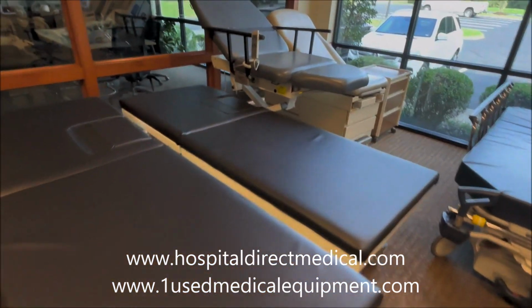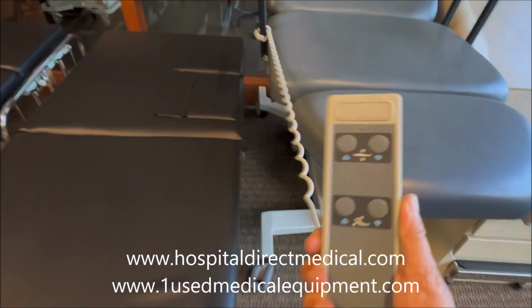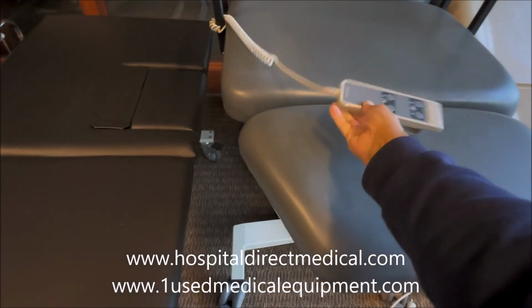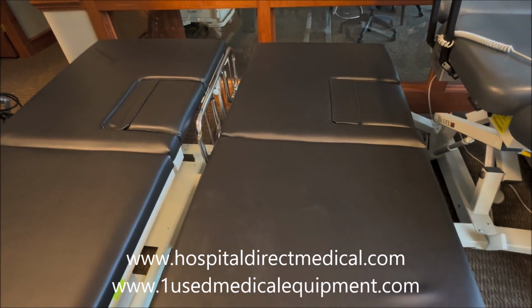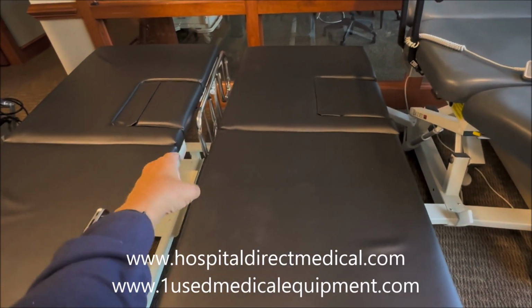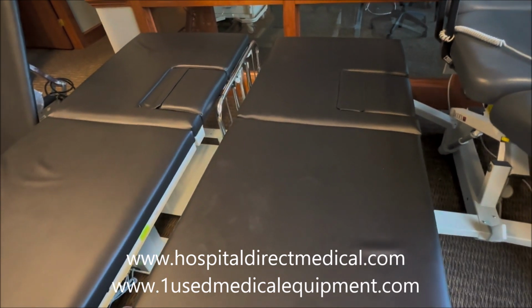When I'm looking at an ultrasound table, the first thing I want to know is what functionality it has. So I'm going to grab it, and as soon as I look at this, I know it's head up and down and power up and down. This is primarily going to be used as a cardiac table. Now, cardiac tables also will have distinct features. Some of them do. These are MPI. This is Biodex. This is another company over here. But cardiac tables will also have a cutout, and that cutout will basically drop a big section out so they can get the probe up along the heart area in the ribs and get a really good study that way.